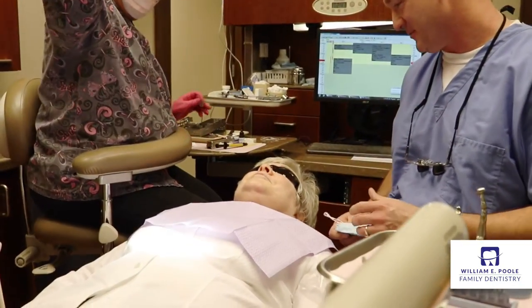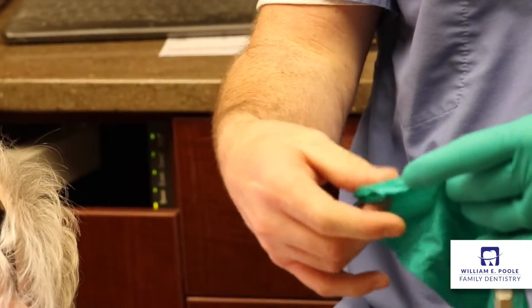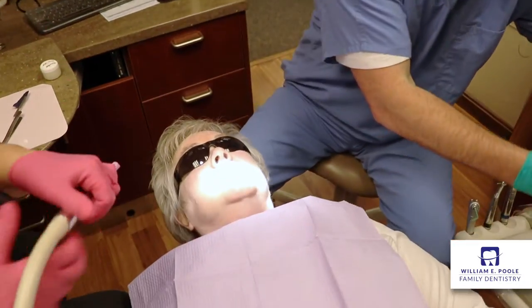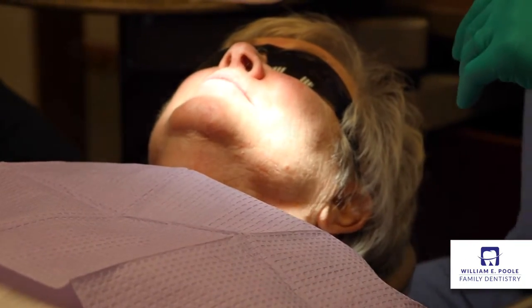Dr. William Poole. I have a family dental practice here in Leola, Pennsylvania. The patient today in this procedure was my mother. She broke a tooth and she gave me a call. She knew that we could fix her in a hurry.